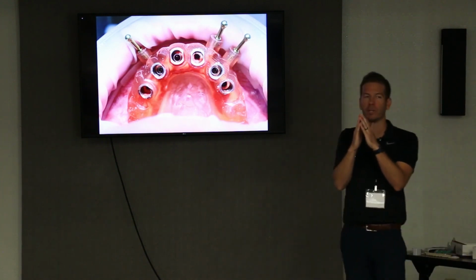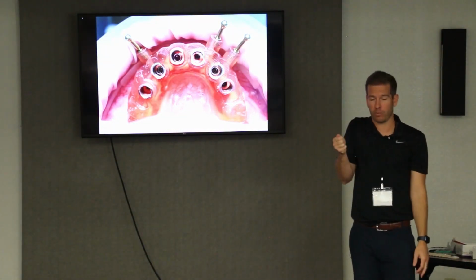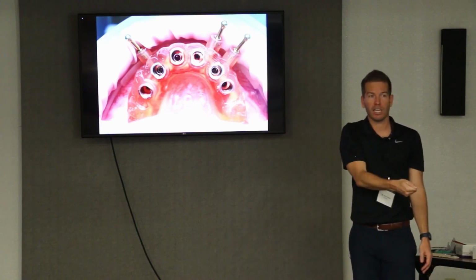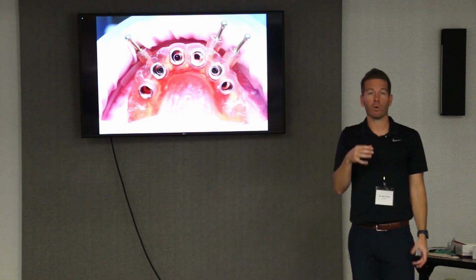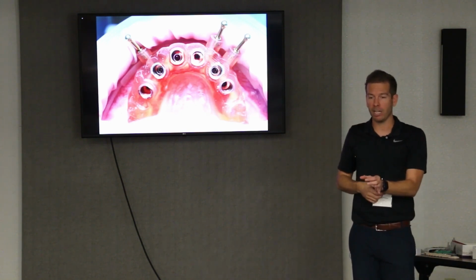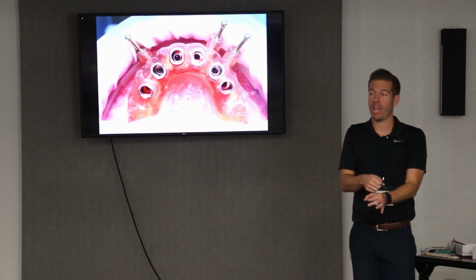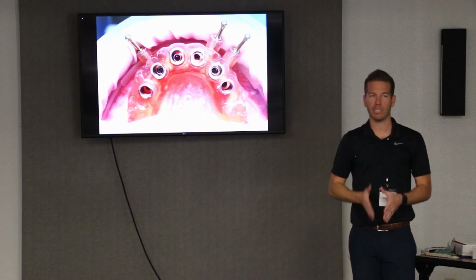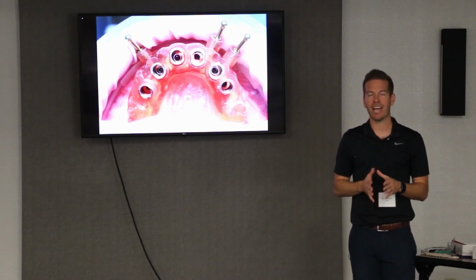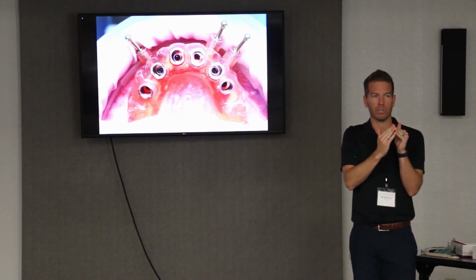Because if you try to enter a ridge with a drill, with or without a guide, if you just take a drill and try to run down a ridge, you slip off. You have to either have a big flat base or a little starter hole. So what I do a lot of times is I have that guide on, and I'll take a long round burr and go through my guide hole, and I can see the ridge, and I'll just kind of peck a starter hole. And then now you can go with your drills, and they're going to find that hole and just go straight through, and it's going to be guided well. But it's not tight enough to hold it against a sharp ridge.